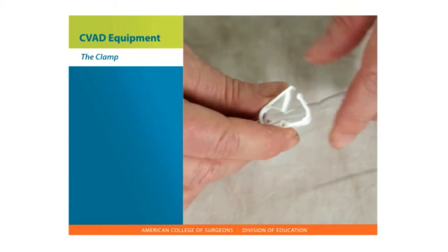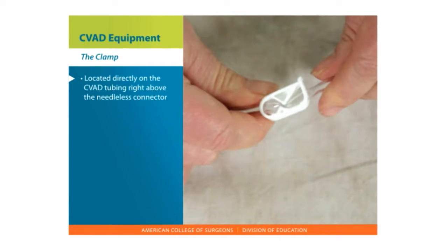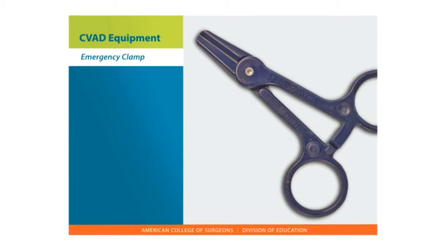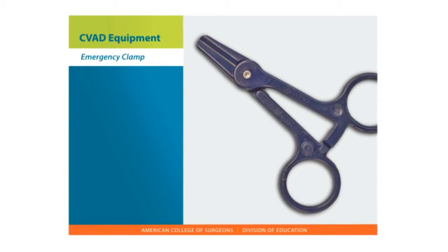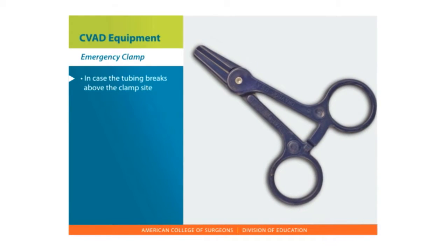The clamp. Clamps or closures are located directly on the CVAD tubing, usually right above the needleless connector, and are part of the IV tubing. The clamp can be a clip clamp, rolling clamp, or sliding clamp. You are often given an emergency clamp to use in case the tubing breaks above the clamp site on the tubing.